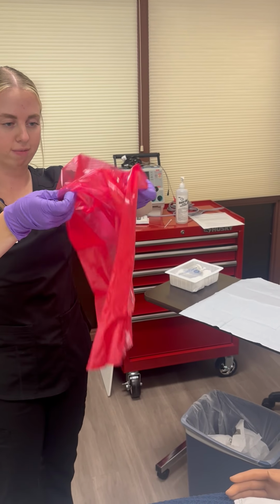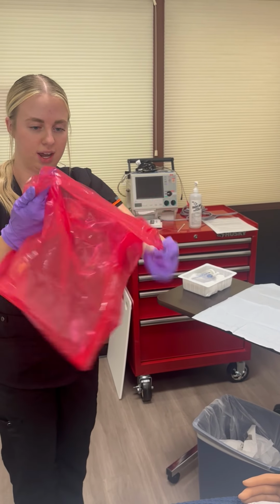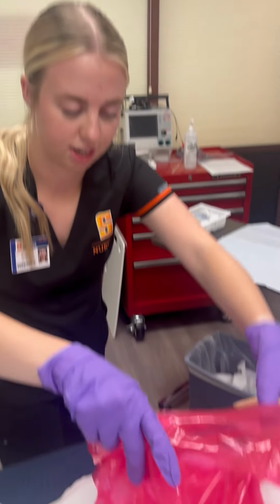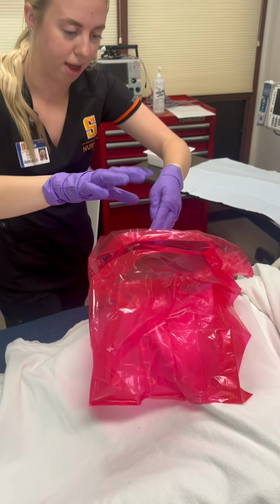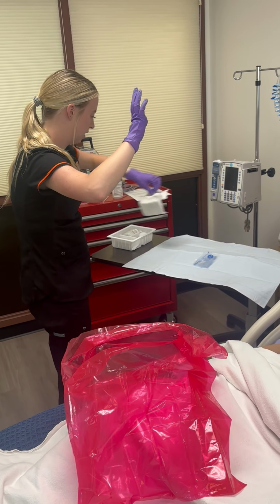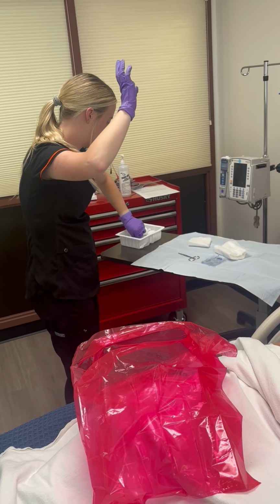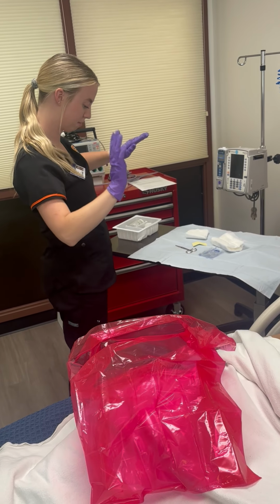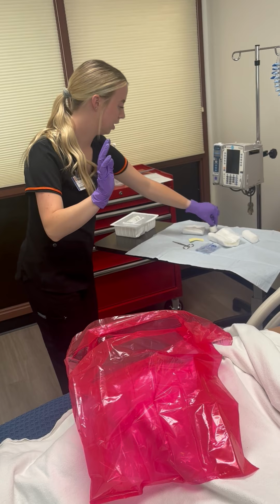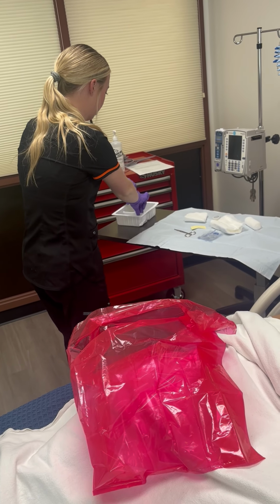keeping my hands above my waist. I'm gonna kind of roll it open and sit it here on the bed. Okay, put this here, set out all my stuff. Okay, keeping my hands above my waist. That was a little high, I apologize. Keep this here. And then now I'm gonna hold this and pull out my fluid.